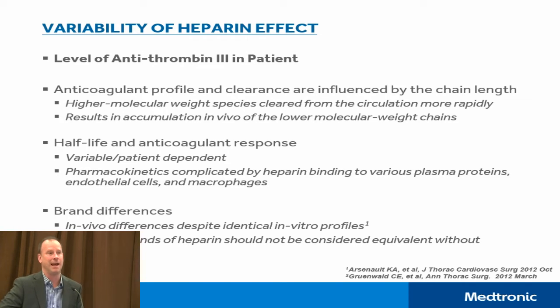The half-life is less now, and I find that when I go into surgery and I'm doing in-servicing or education on the HMS or a trial, the consumption rate and the drop of the heparin assay in relationship to the metabolism is faster now than before. Usually you could say, I probably don't need to give heparin all the time, every half an hour, every 45 minutes. I see a lot where you do. And it's not a function of that darn machine always wanting heparin. It's picking up that you need heparin, but it's a big function of the lack of efficacy of this newer heparin that kicked in 2012.